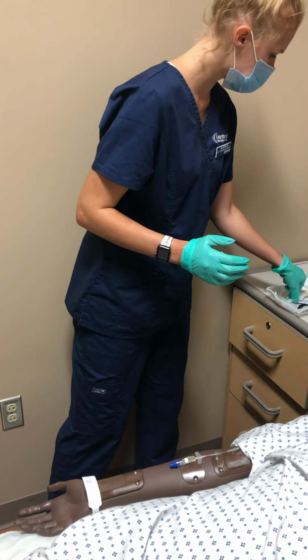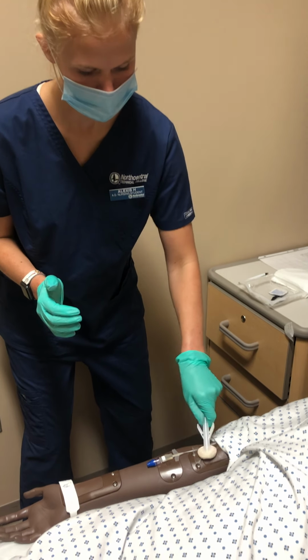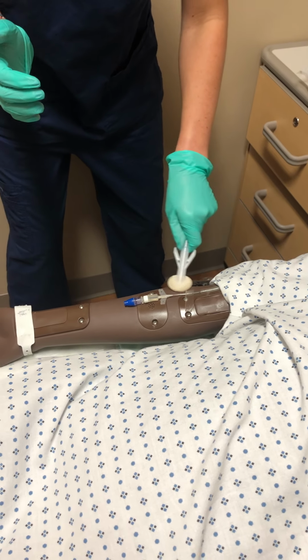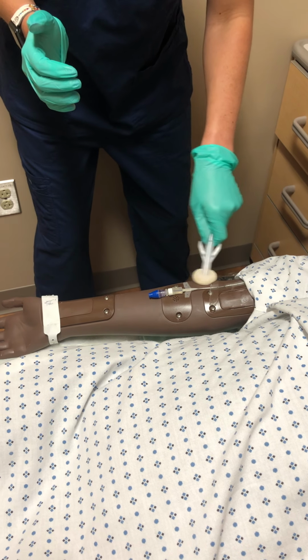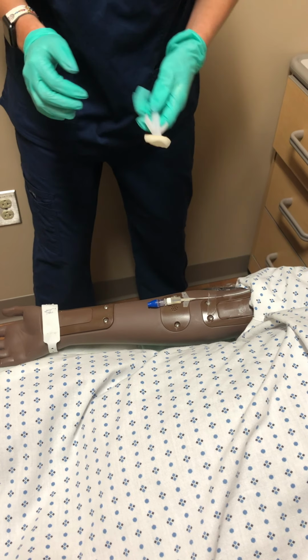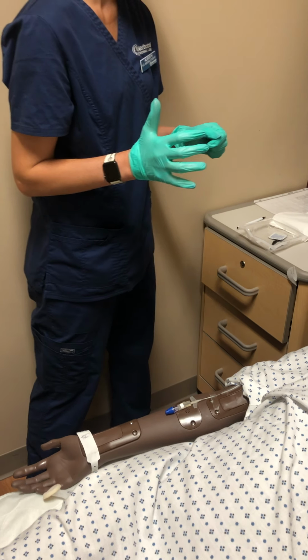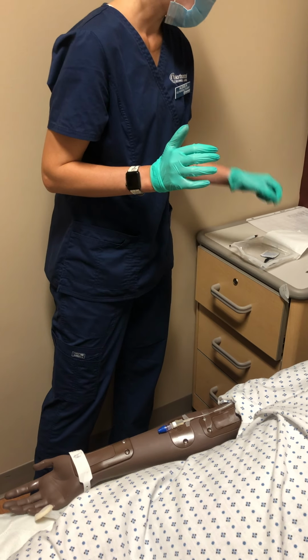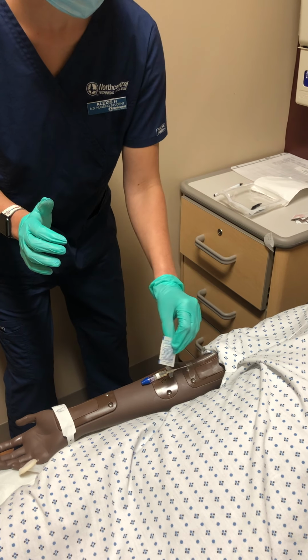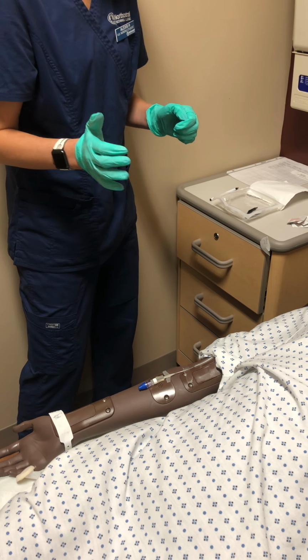So next what I want to do is crack this, and then go ahead and use friction for 30 seconds or per agency policy. And I would not touch that sleeve right there. I'm going to go ahead and discard that. And then I'm going to take my skin prep and make a circle, a big square, around the oval window, or a window.